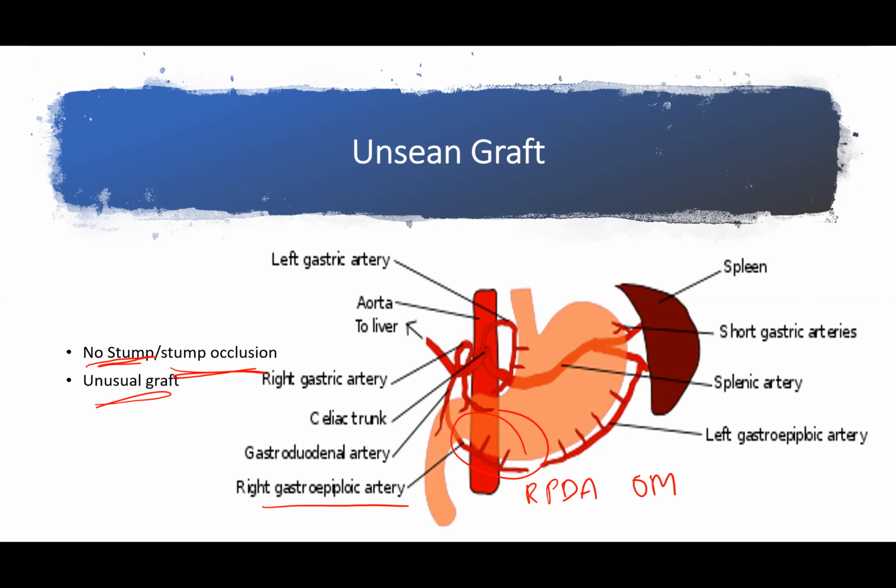And to get it into this artery here, the celiac trunk, you sometimes might have to use some specific visceral artery catheters like a Cobra catheter, or you can talk to your interventional radiology colleagues about how to take care of it. But you wouldn't know it if you don't have the operative report. But this is something that you always have to keep in your mind.